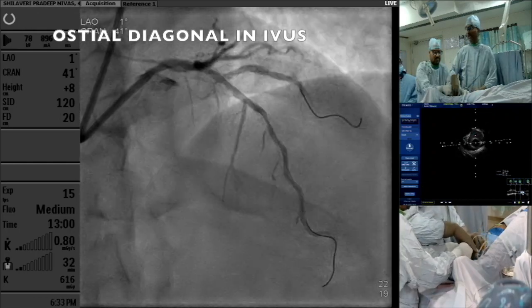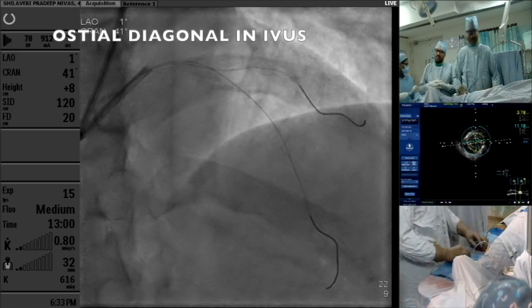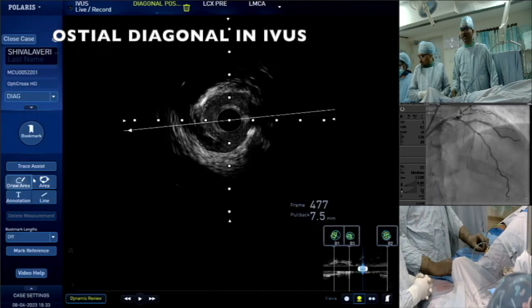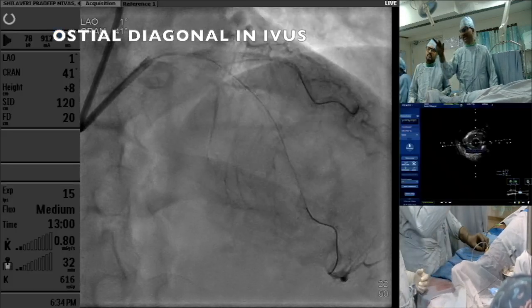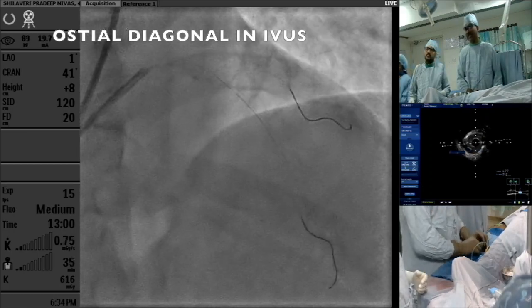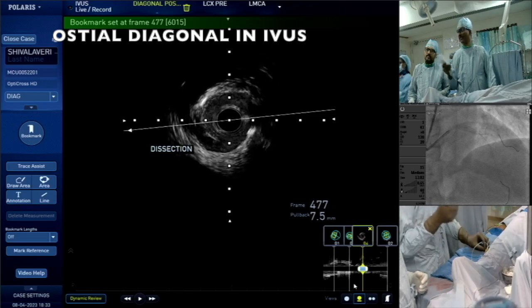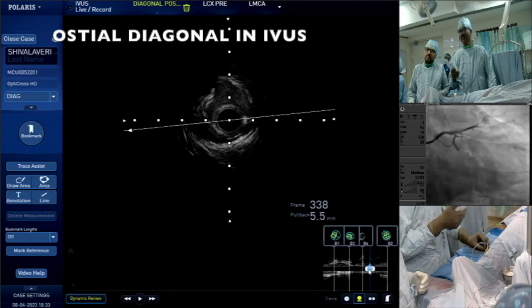All right, so you can show that dissection area, right? See, this area, a side branch, we see a bit differently. This is a bit tricky side branch. So I mean, we have two approaches here. See, basically, MLA is quite okay for me. So based on MLA, my decision would be you can leave it. But the flap, you can see the length of the flap is very short, which Damodar can show you. And if you see the overall angle, it is also around 30 degrees.